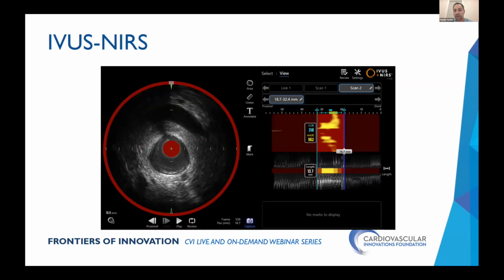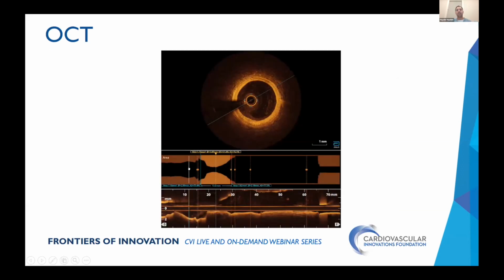And here we go. These are the numbers. So I just do the measurement just like you do with any longitudinal section on IVUS. I have a 13.7 lesion. I'm now thinking 15 millimeter stent, and I know that my LCBI over 4 millimeters is 562. So there's enough disease in that area for me to say that this is vulnerable plaque.